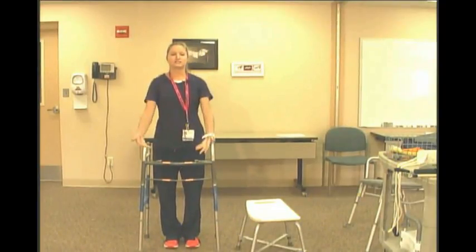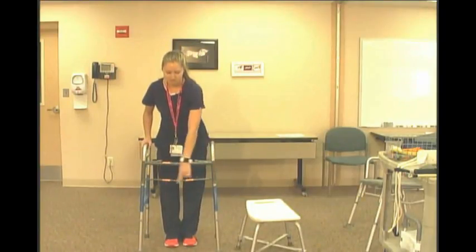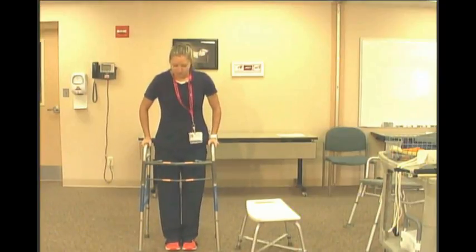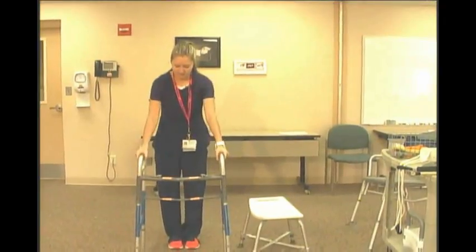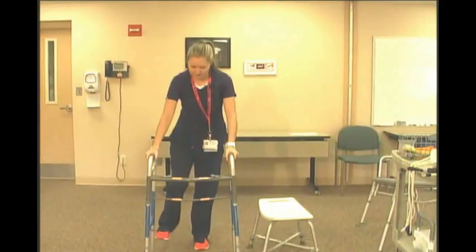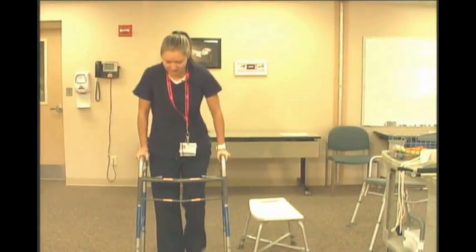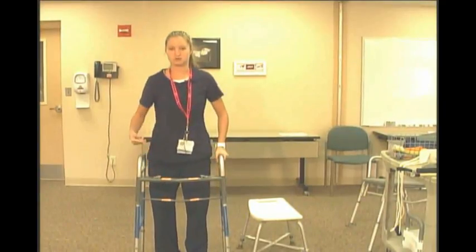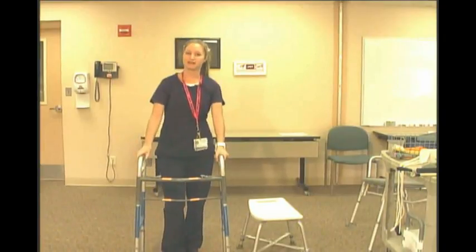If your walker fits into the shower, it's quite simple. If you imagine that the lip of the shower is right there and I'm going into the shower, you get your toes up as close as you can. Walker goes up and in first, and then I always have you step with the sore leg first. I find it's a little easier to get that one over, and then you're going to push through your arms and get the good leg over. This way you've eliminated the weight that goes onto that sore leg when you're stepping in and out. It would be the same way when you come back out.